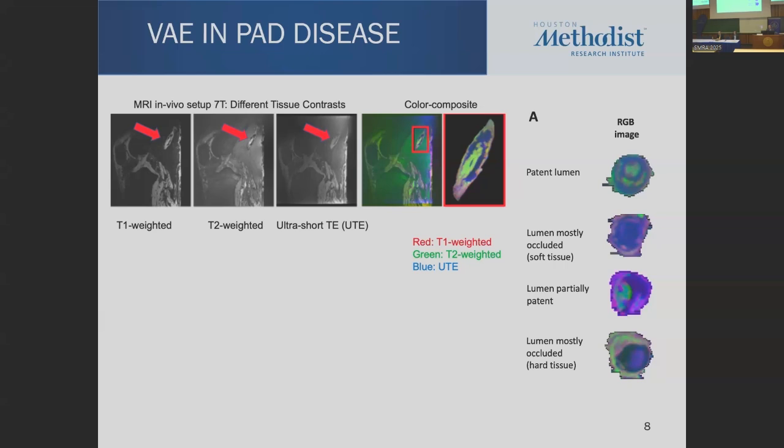So why is that? Because when you do endovascular treatment planning, you want to get through that lesion, right? You want to be able to cross that lesion. And if it's calcification or if it's collagen, then there are difficulties. If it's maybe thrombus or any other soft lesion, then you can easily cross here. So T2 weighted, by hyperintensity, gives you maybe either patency or maybe fatty deposits or thrombus. And UTE dark, of course, is calcium or collagen.